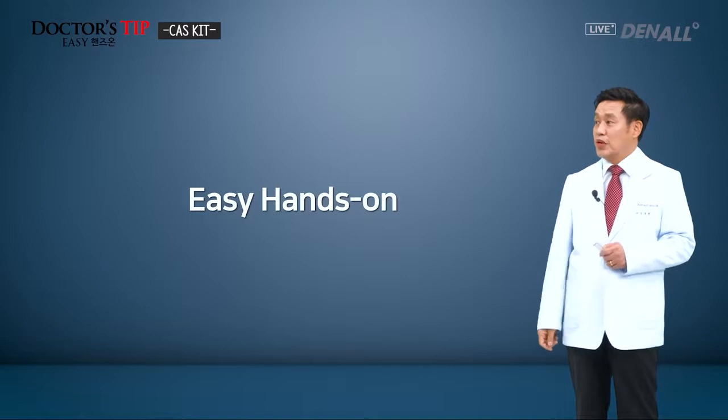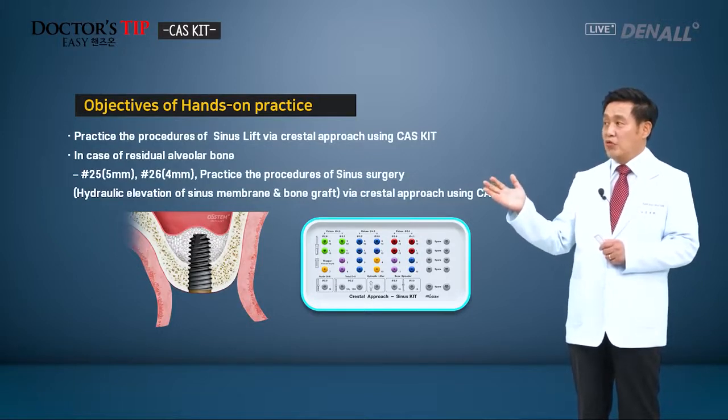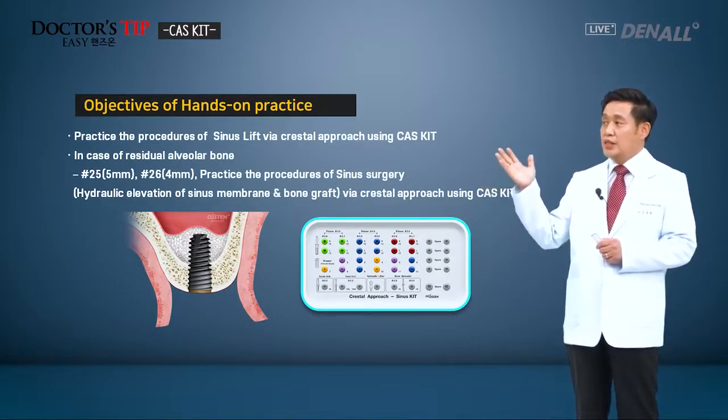Next, easy hands-on. The objectives of the easy hands-on. On the model, CAS KIT will be used.